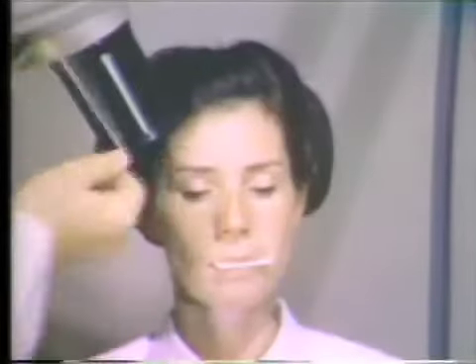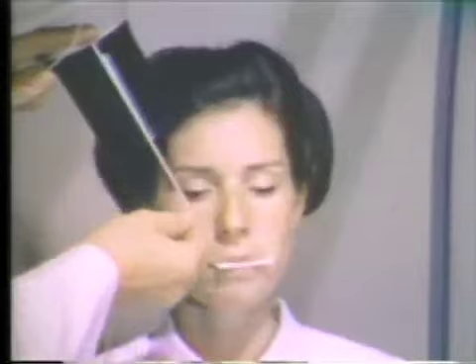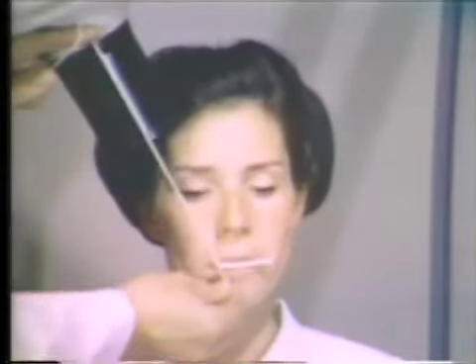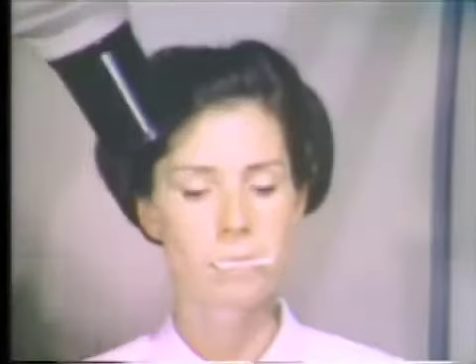This is one way cone cutting takes place. Careless positioning of the X-ray head has directed the central ray through the edge of the film instead of the center line.